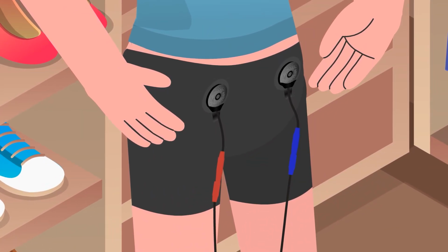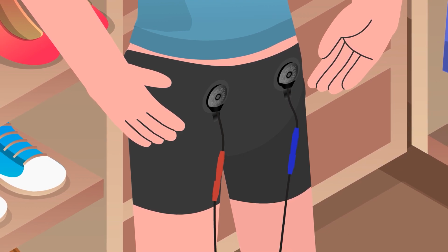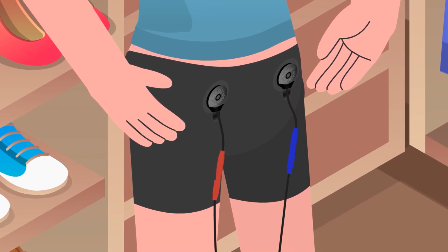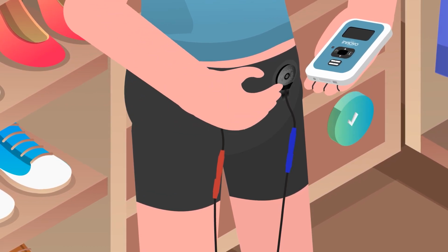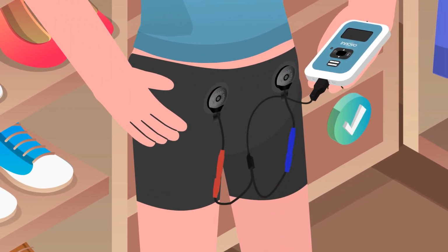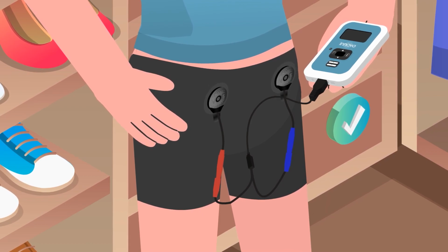Connect both ends of red cables together. Then connect both ends of blue cables together. You will hear the cables click together when securely connected. Then proceed to connect the cable to the controller. You may need to slide the doors open.